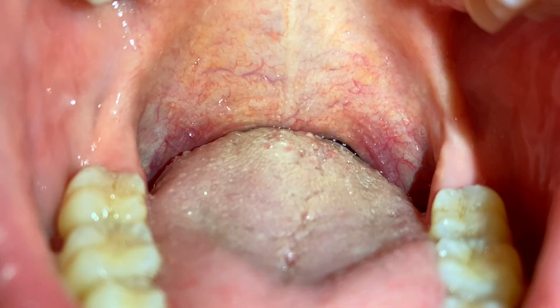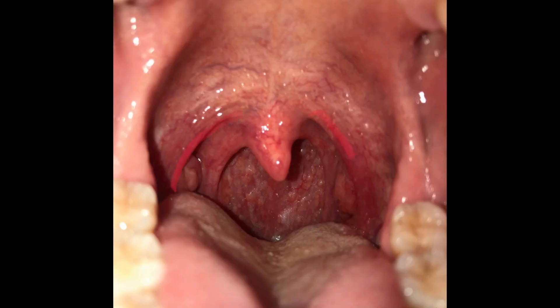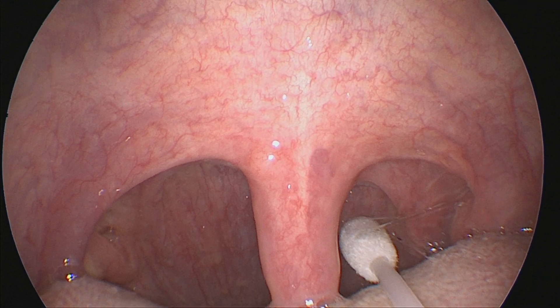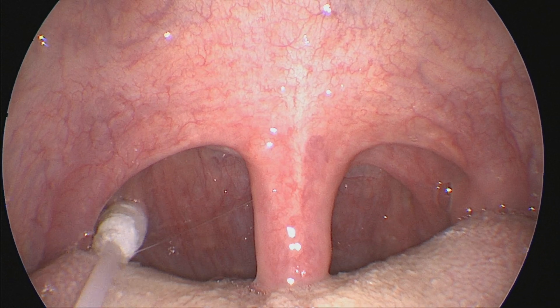Ask the patient to open the mouth and say 'ah' so the soft palate will rise and improve visualization. You can now see the anterior pillar of the fauces and the posterior pillar behind with the uvula in the middle and tonsils between the pillars of the fauces. In the back, you will see the posterior oropharyngeal wall from where the specimen sample should be taken. Insert the swab without touching the tongue and gums. Now rub the swab over both the tonsils and the posterior oropharyngeal wall with a rotating or painting movement. Withdraw the swab without touching the cheeks, teeth, or gums.